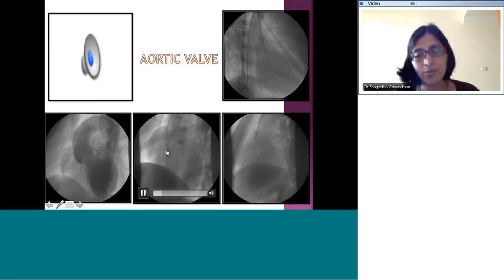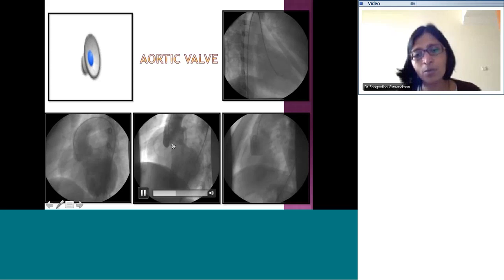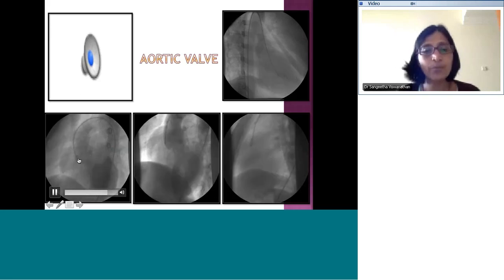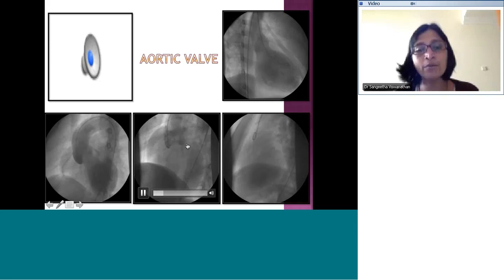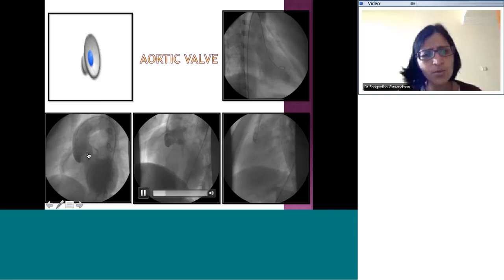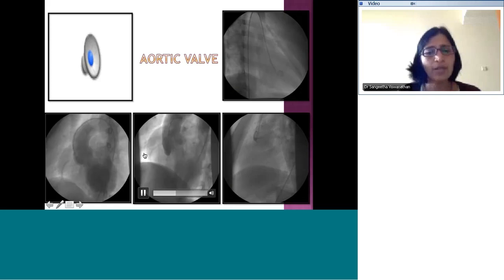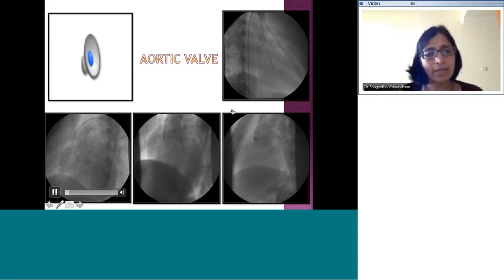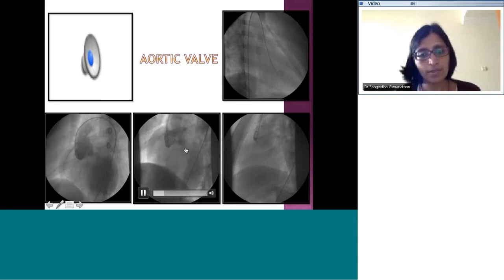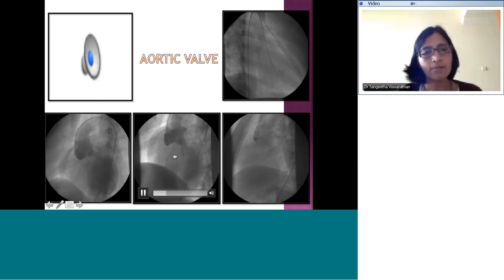This angiogram does not clearly show the VSD but the morphology of the aortic cusp is not normal and there is definitely AR — which may be catheter-induced, so you would pull the catheter back and redo the angiogram to determine whether this is pathological AR. Now look at these two angiograms — both in LAO cranial. Which is steeper LAO? The one to the right. The cardiac silhouette is more shifted, the IVS is lengthened more — it's a very nice comparison of how the IVS profile changes depending on how steep the LAO is.